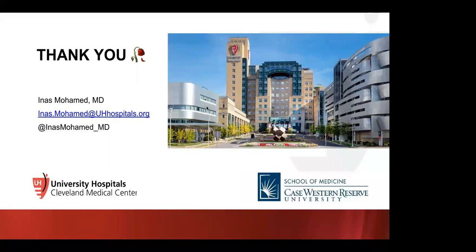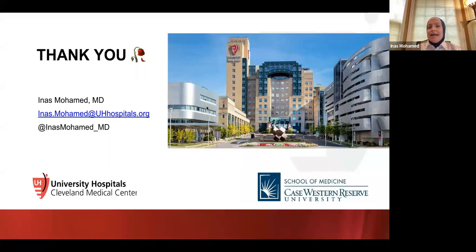Thanks. Dr. Ines, I just want to ask you about the coexistence of focal nodular hyperplasia and adenoma. Yeah, it's a dilemma. When you look at multiple liver lesions on MRI, it's not usually just one lesion.